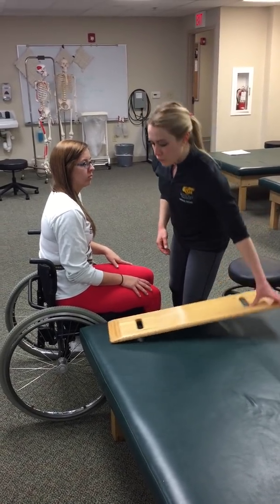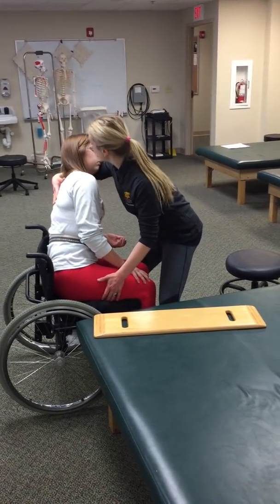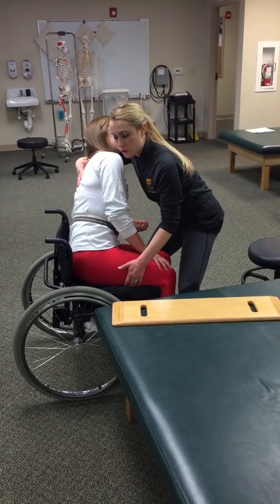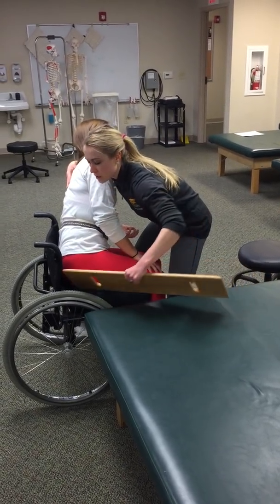During the transfer, they can actually pinch their fingers doing this, and it can also stop the progression of the transfer. So before we go, I'm going to come over here and help her lean just a little bit. And if she's able to help me, I do want her to help me out a little bit here. We also don't want to let go and let the patient fall over. So what we're going to do is take the sliding board.